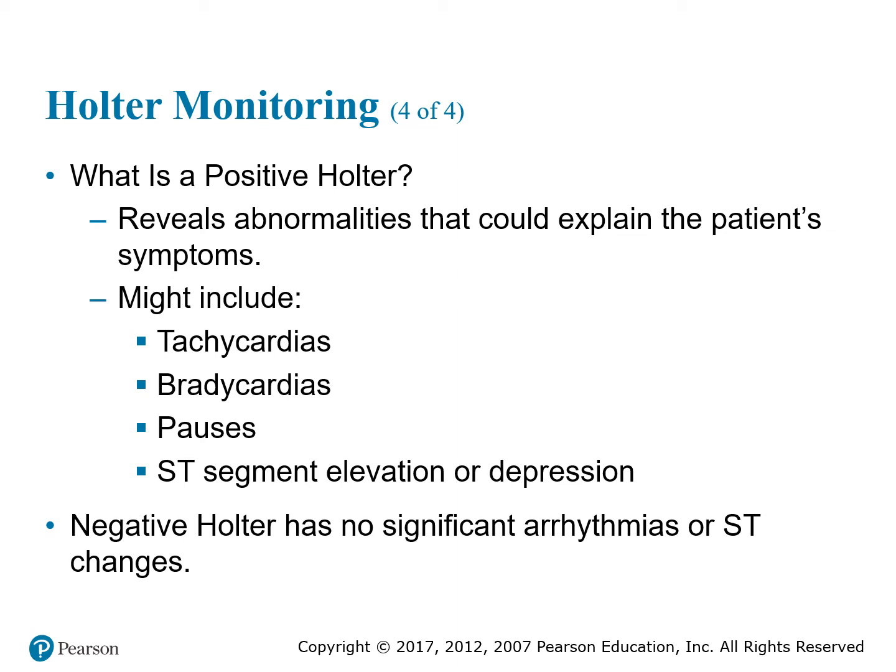The patient is advised to document any symptoms experienced while on the Holter monitor in a small diary provided for that purpose. By pressing the marker button on the Holter monitor, the patient marks the point in the EKG at which he or she feels symptoms, so that this part of the EKG can be more closely examined for changes that could have caused the symptoms.